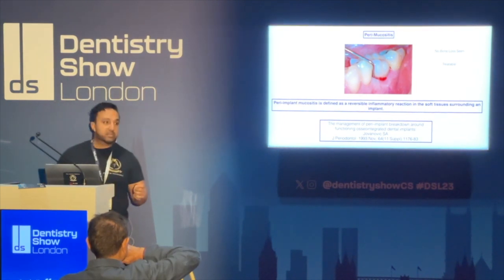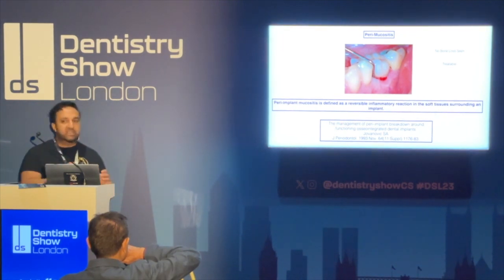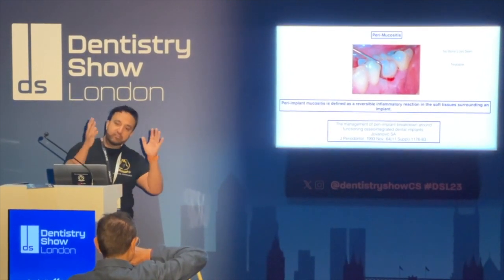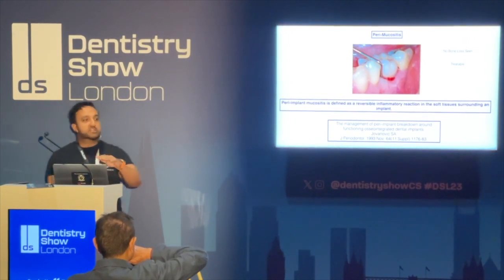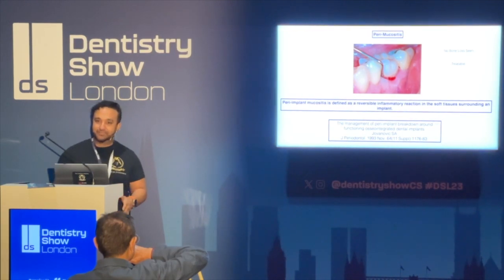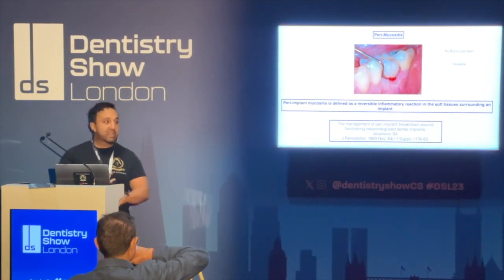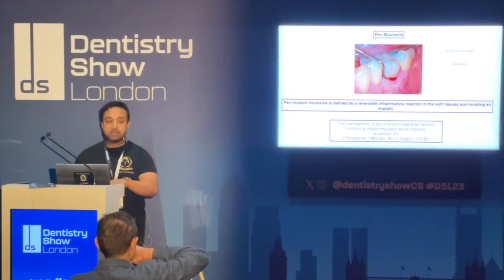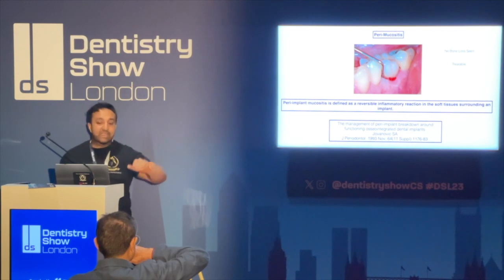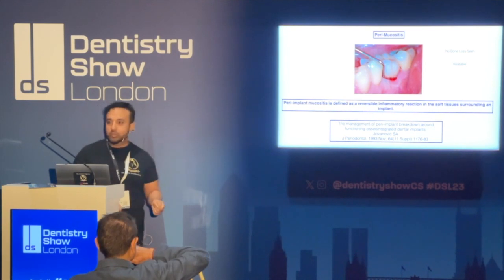Okay? So we air abrade the pockets. Now, implants are slightly different to teeth, as in the pocket depth means very little. So hear me out on this. When we first place an implant and we've done the final restoration, depending on the thickness of the gum that you started off with, that's where your baseline pocket chart should be taken. So we take a 3-point pocket chart around the implant itself, and that might be 8, 10, 11 millimeters. Now, it doesn't mean that implant has any perio disease. It just means that's the starting base point. You then yearly, when you see the patients to review them, take another pocket measurement and compare it to your baseline.